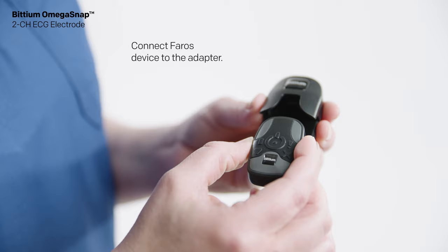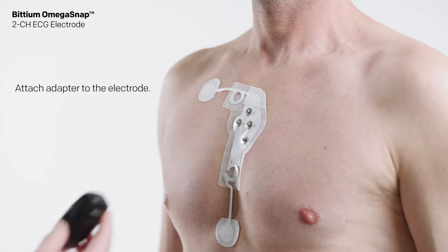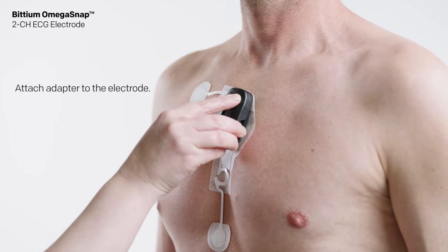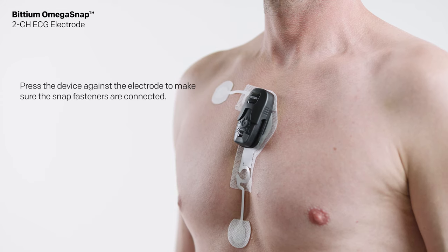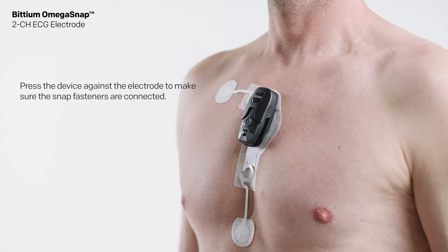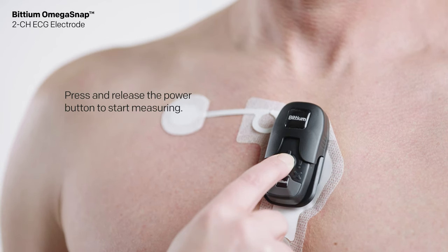Connect the Faros device to the adapter. Attach the adapter to the electrode and press the device against the electrode to make sure the snap fasteners are connected. Press and release the power button to start measuring.